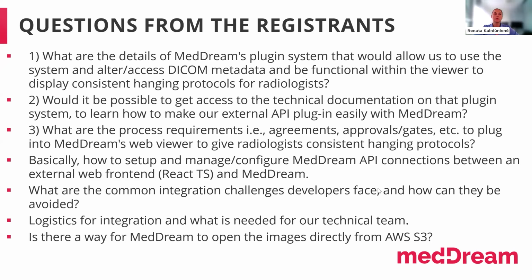Okay, thank you. Another question. Basically, how to set up and manage, configure MedDream API connections between an external web front-end, React, TS, and MedDream. Yes, so this is basically what we showed in the communication API examples. The last example was with the communication API and links plugin. So this was demonstrated, how to do this. Okay, thank you.